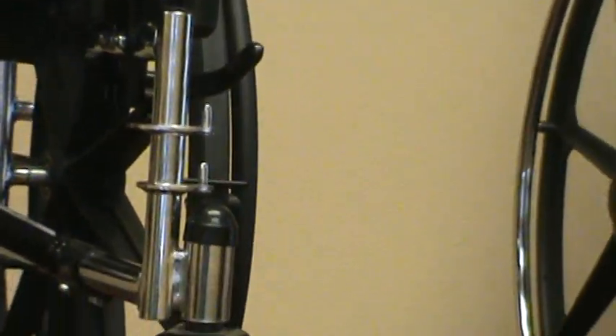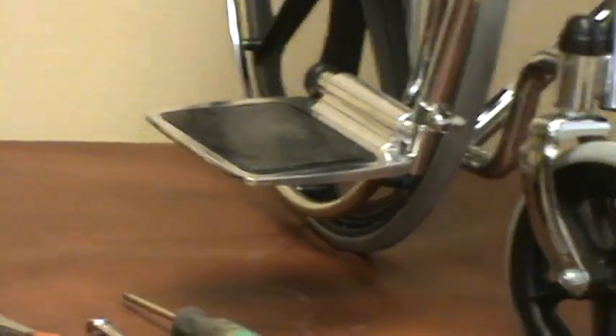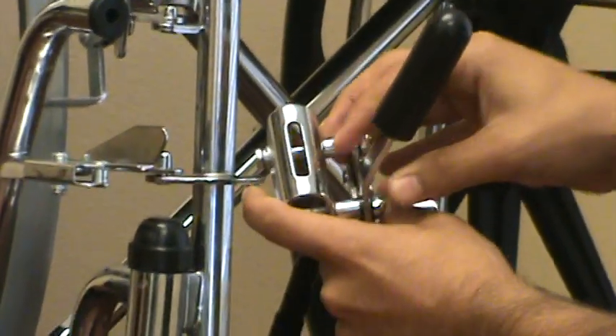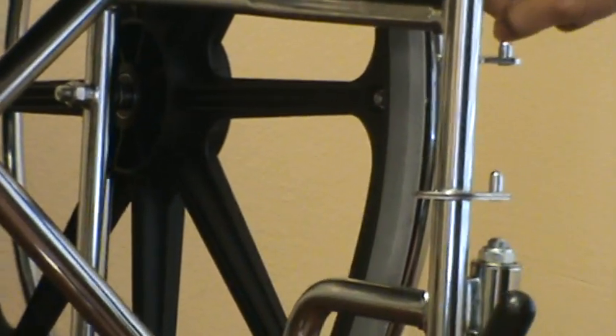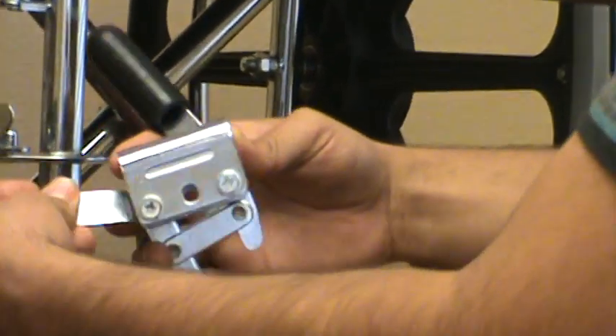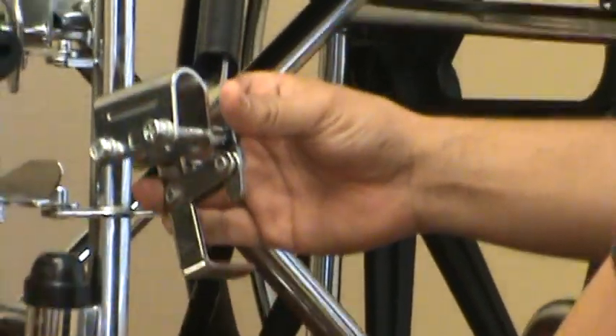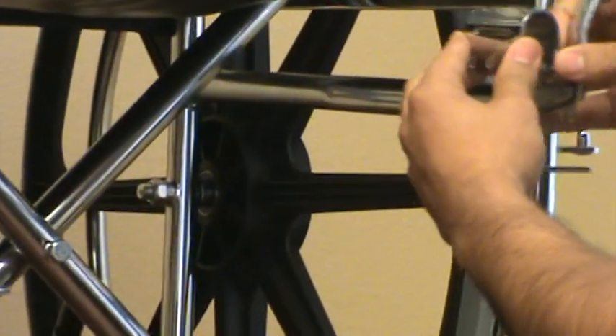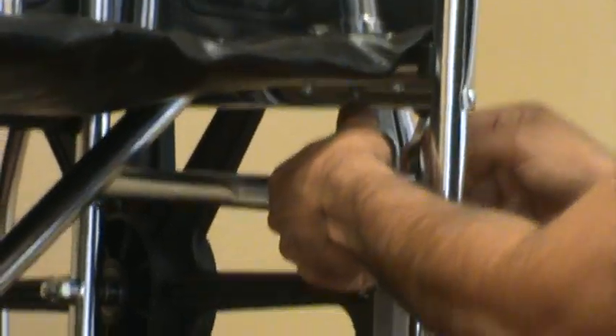For the over-the-bar clamp style, you'll notice that the top of the wheel lock has a slot in it. That slot matches up with a stud sticking out of the frame, and that keeps your wheel lock in the right position. You would take off your two bolts and the spacer that comes out from between, then put it over the bar. Make sure that your stud goes into your slot — you can slide it back and forth on there.